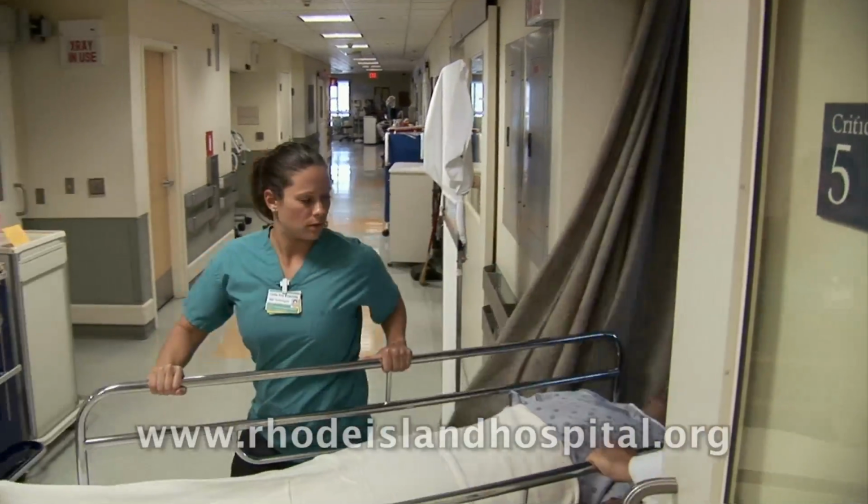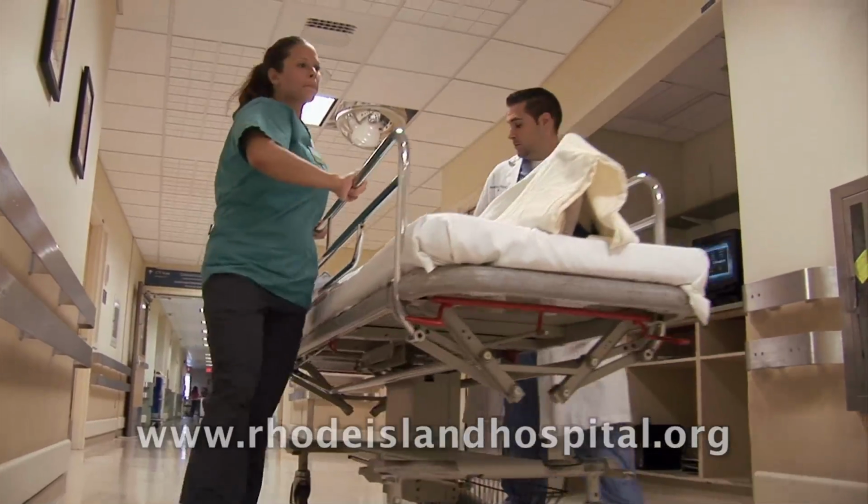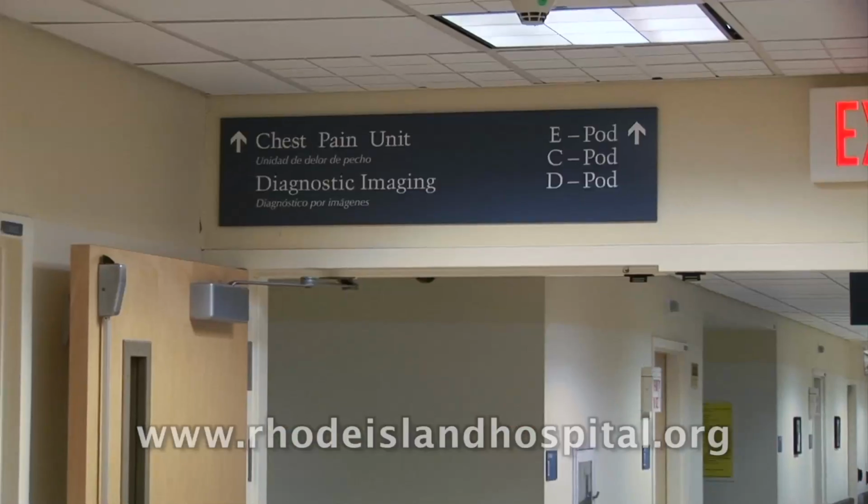We're able to provide that to them sooner, just as we're able to prevent a hospital admission for a patient that needed an MRI for a transient ischemic attack by getting it earlier in the department and then sending them home. It's the number one technique to decide if a patient has a stroke, hemorrhagic or non-hemorrhagic, and needs to be treated. So it's very important for that.